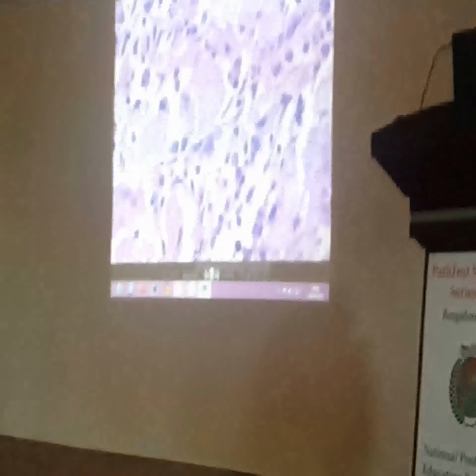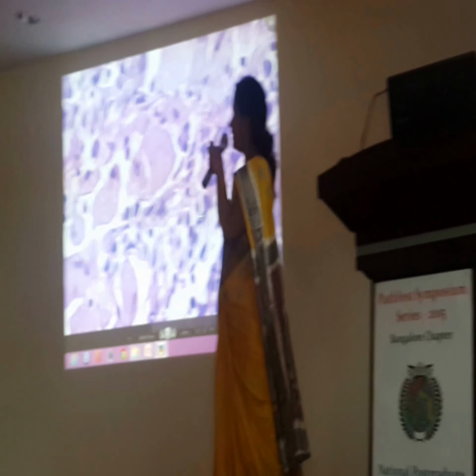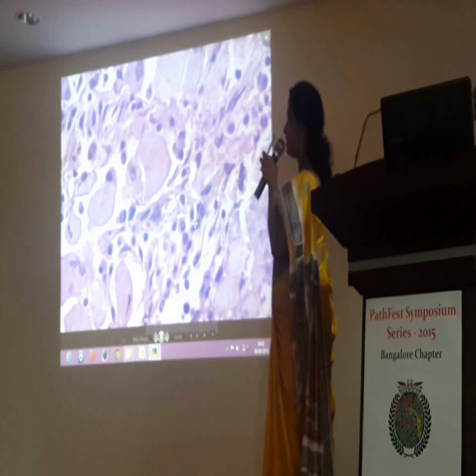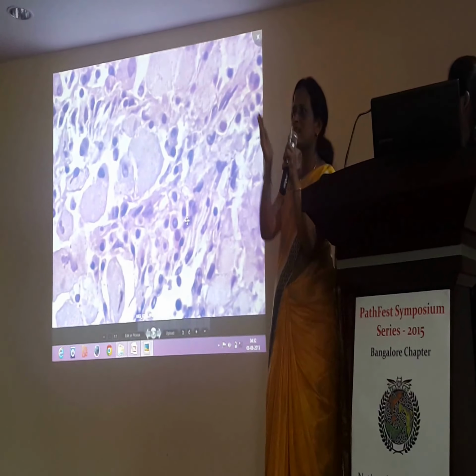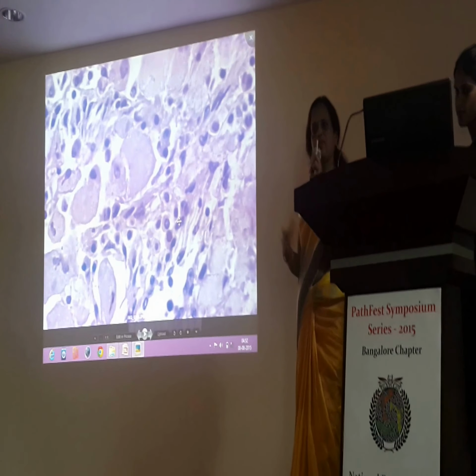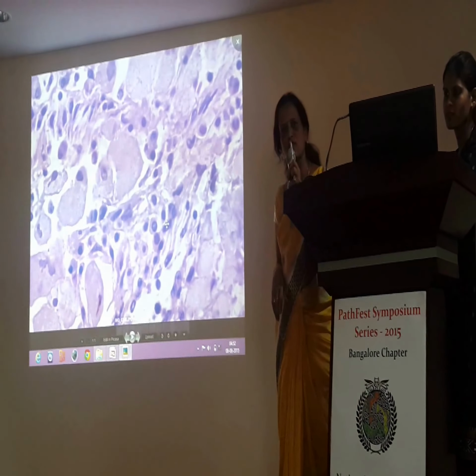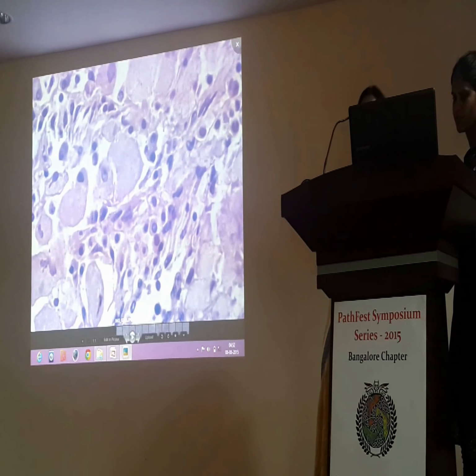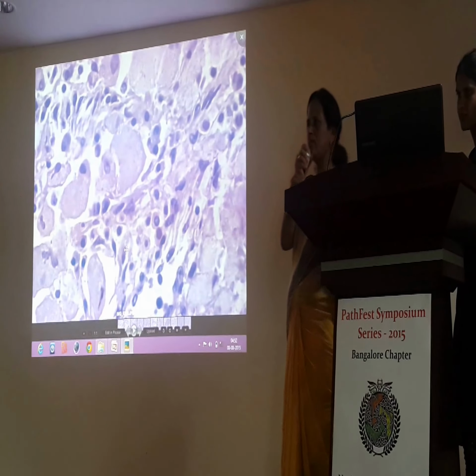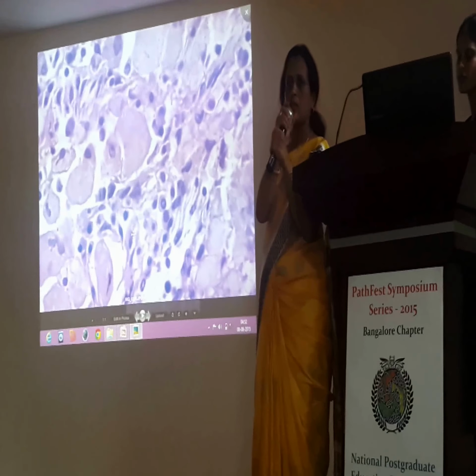And somebody described the cytoplasm as a crumpled tissue paper appearance. So that means it's not vacuolated. No, there are strands of cytoplasm. So then you're directly there. You have hit the diagnosis. Gaucher's. So these are Gaucher cells. Many times splenectomy is done for Gaucher's.